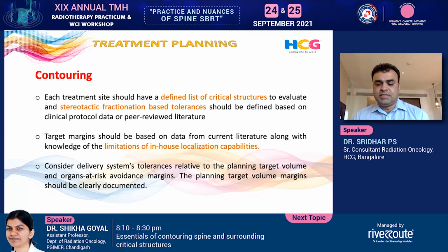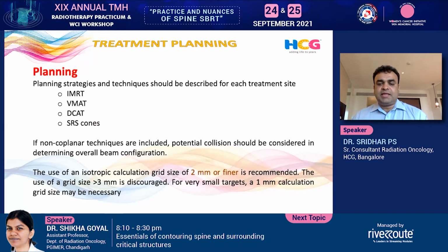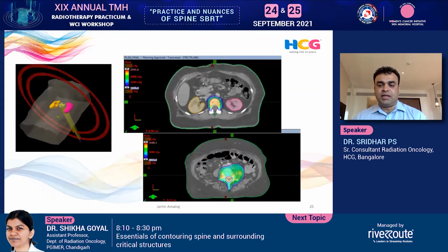But I don't practice any extra margins as a PTV, because your imaging guidance is very, very good. The planning evaluation is a separate topic, and I don't want to go into that. You need to keep those things in mind. Whenever you're planning and evaluating, your immobilization techniques should also be kept in mind.